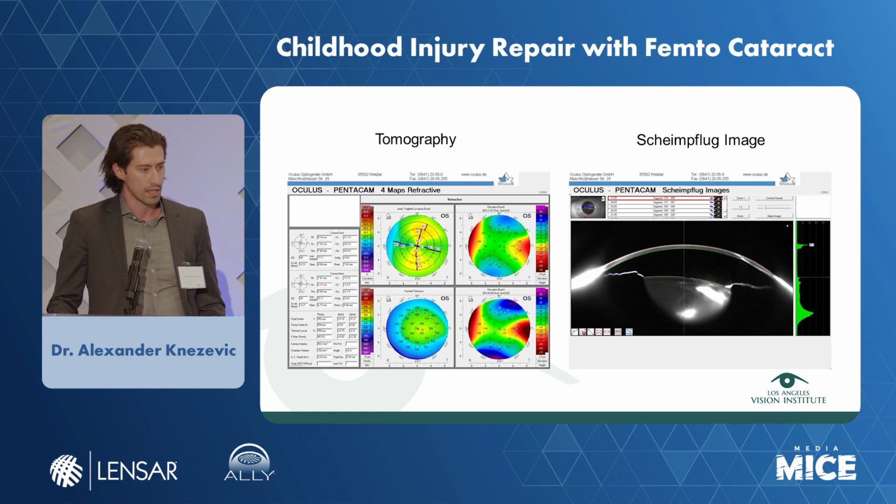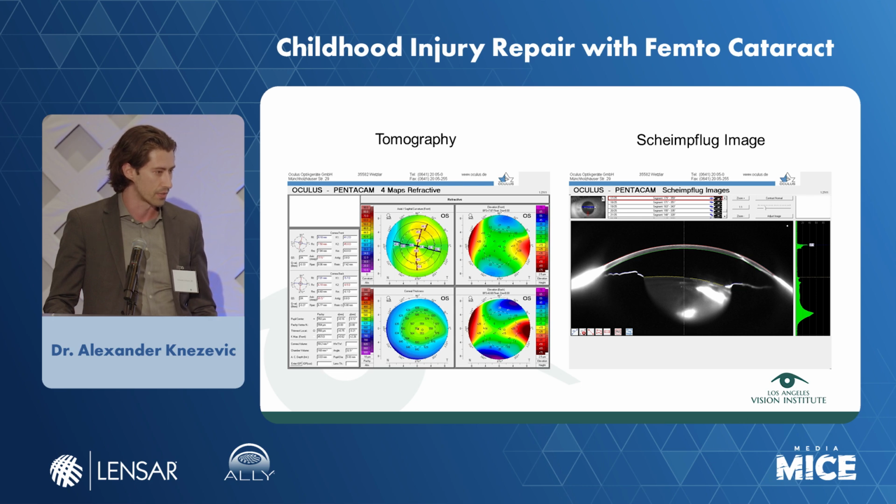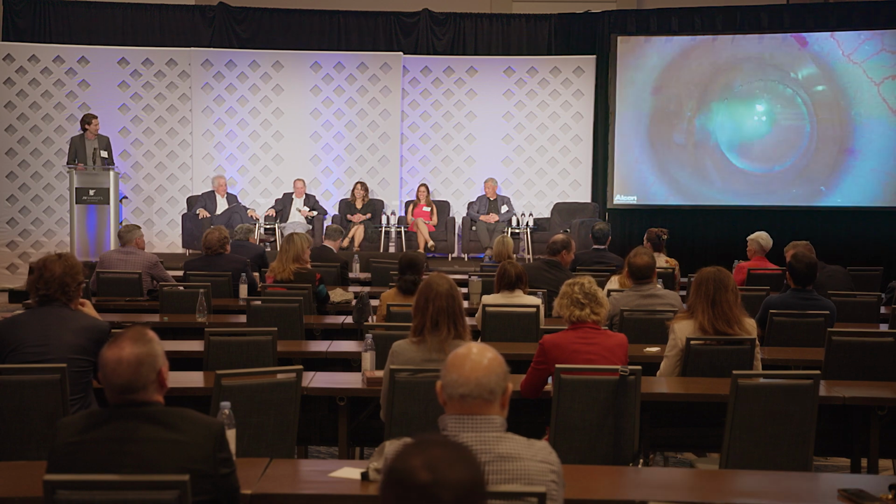And you can see here on the imaging, so on the cross-sectional images, so penetrating injury goes all the way through the cornea, through the iris, anterior capsule, into the lens, and I think into the posterior capsule. But surprisingly here, when you look at his tomography, it's very regular, right? I mean, this really looks like somebody that would benefit from a toric IOL. I'll talk you guys through the video here.